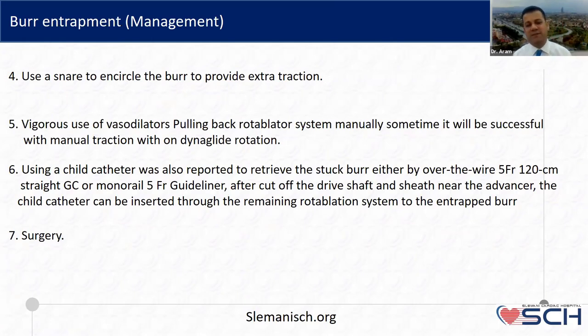Use of a vasodilator, because sometimes there is some spasm. When you have severe calcification and spasm on it, it might cause the burr to get trapped. So in hope that you release the burr, it's better to give some sort of vasodilator frequently, if the blood pressure allows you.